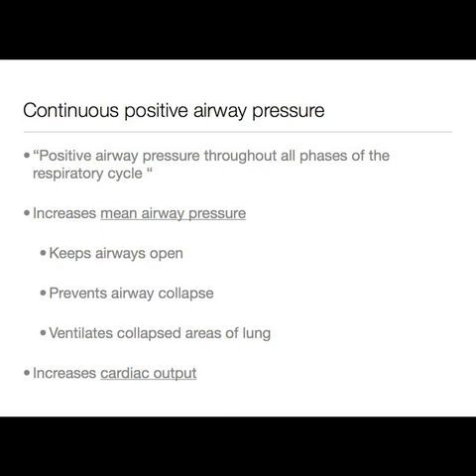This raises the mean airway pressure within the lungs to keep airways open, prevent airway collapse, and even ventilate collapsed areas of lung. It is therefore most useful for oxygenation in type 1 respiratory failure, where the PO2 is less than 8, but the PCO2 is normal or low.